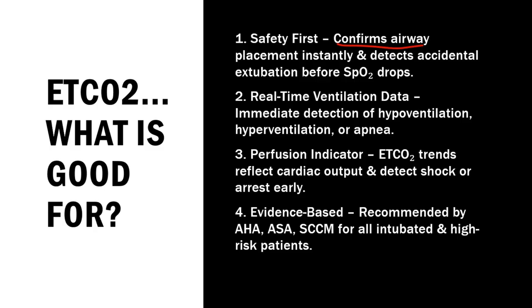It's fantastic, especially for post-intubated patients. So you've taken the ET tube out of the patient, they're back breathing on their own, but we're still concerned of how they're going to do respiratory wise. They make nasal cannula end tidal detectors, and if that end tidal starts to climb, it tells us, hey, they cannot breathe adequately enough to expel that CO2. We probably need to come in either with some BiPAP or with another breathing tube to prevent them from gaining so much CO2 that it makes them acidic again.